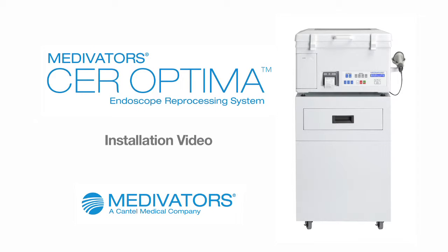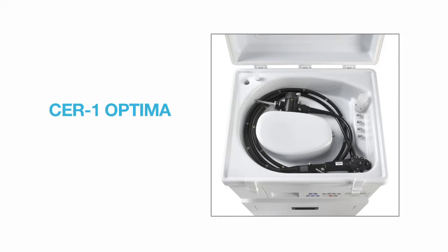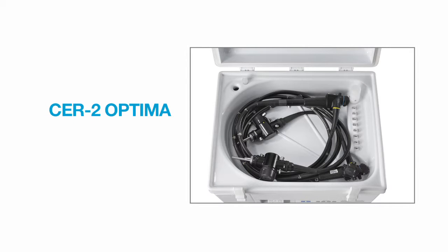The CER Optima system is an efficiently designed, fully capable, compact automated endoscope reprocessor. The CER Optima is available in two different models. The CER-1 Optima is capable of reprocessing one endoscope at a time, and the CER-2 Optima is capable of reprocessing up to two endoscopes simultaneously.